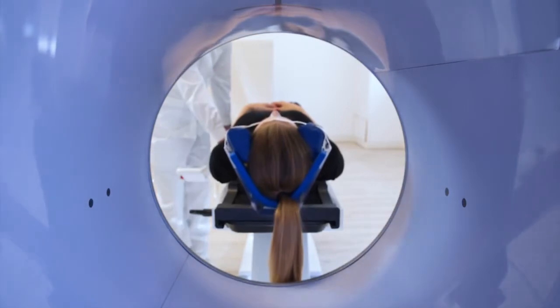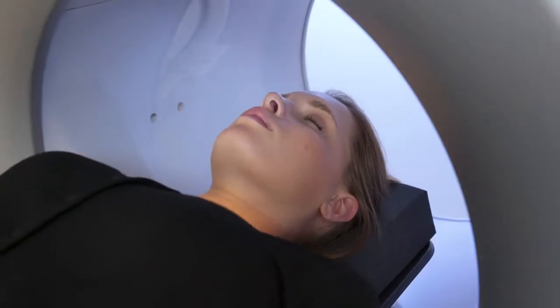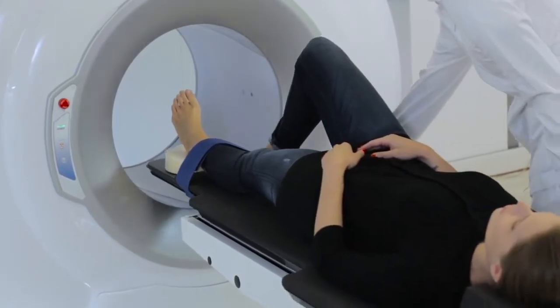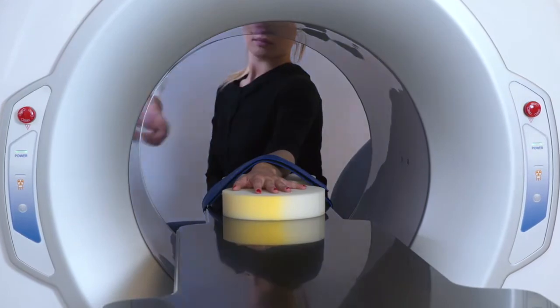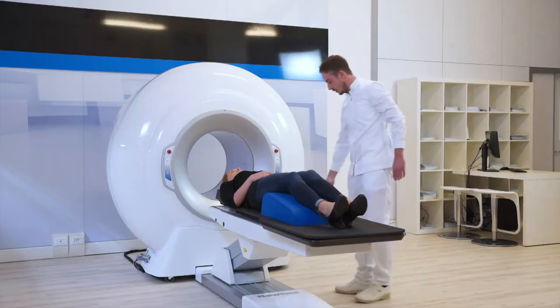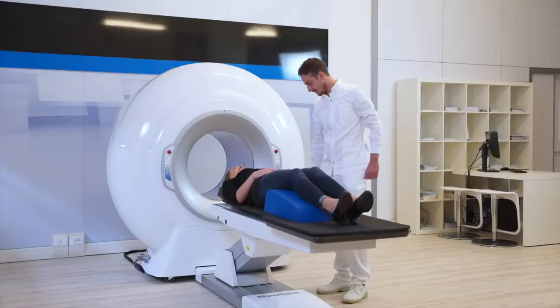We are going to describe the procedure to examine the anatomical region of the skull and neck. But with NewTom 5G XL, scans can be performed of the lower limbs and upper limbs too, with the patient lying down on the table, or even sitting using a chair, with access to the gantry from the back of the machine. Once the anatomical region to be examined has been selected, the patient must be brought to the scan preparatory position by pressing the P1 key.